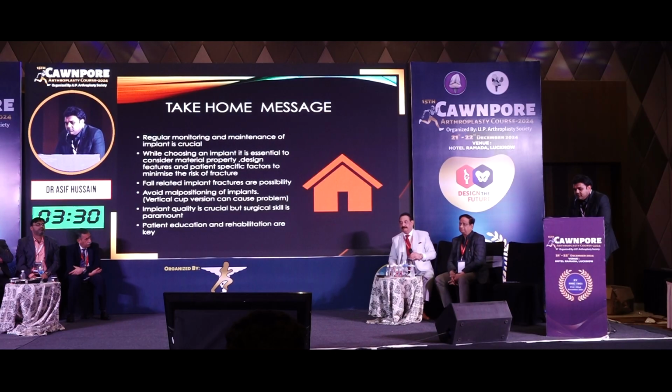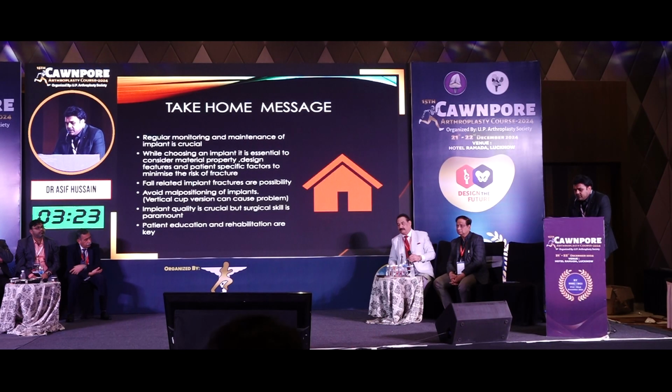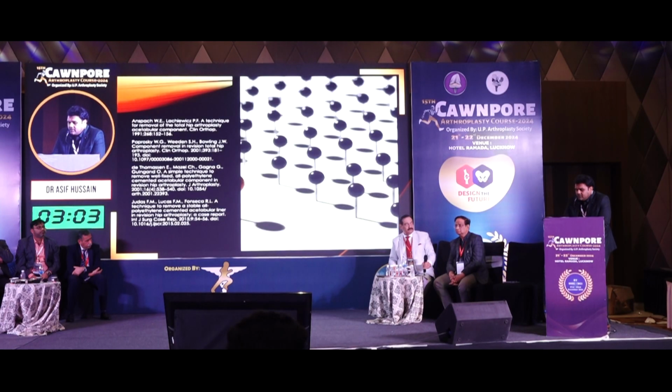So the take-home message: regular monitoring and maintenance of the implant is crucial. While choosing an implant, it is essential to consider material property, design features, and patient-specific factors to minimize the risk of fracture. But fall-related implant fractures are possible, sir. Avoid malpositioning of the implant. Implant quality is crucial, but surgical skill is paramount. Patient education and rehabilitation are the key, sir.